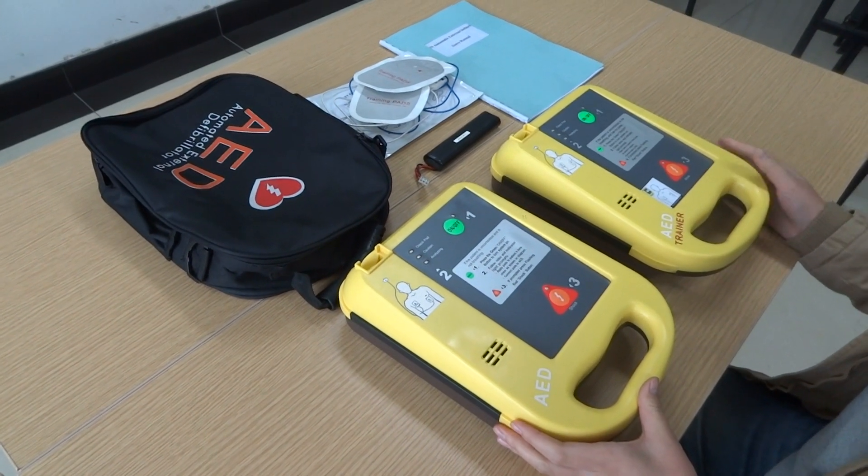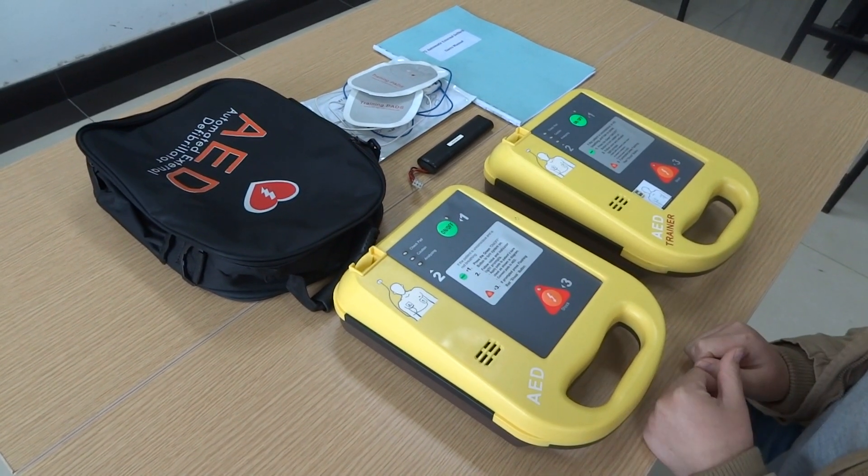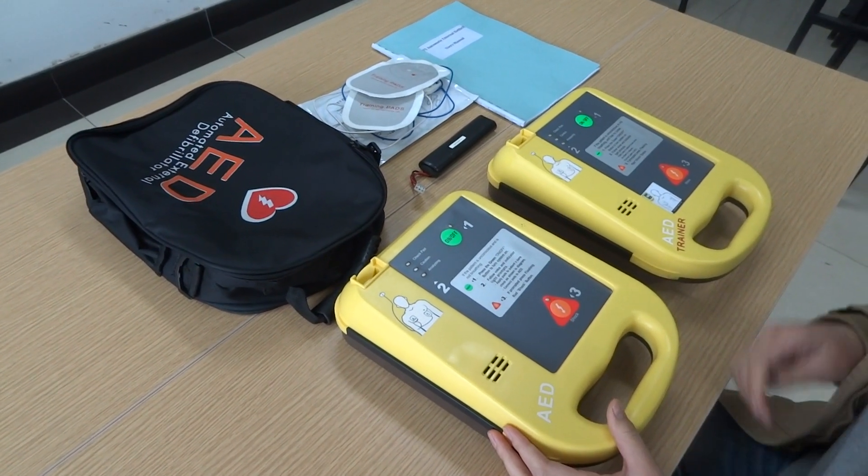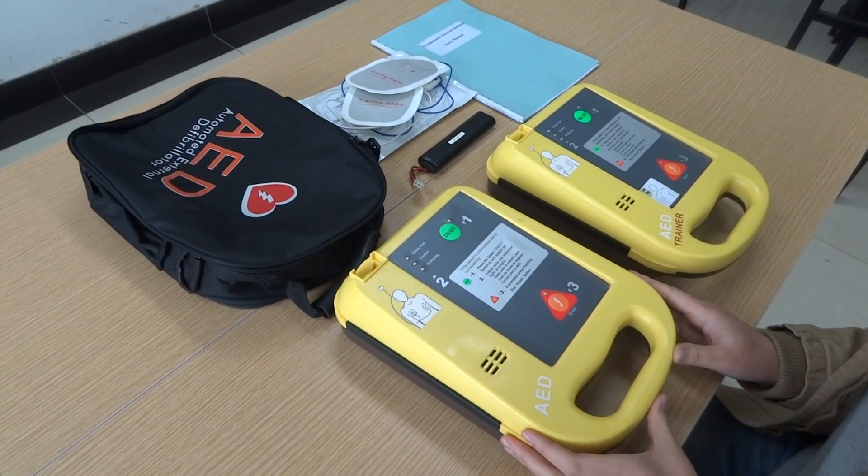Dear customers, thanks for using our automatic external defibrillator. Let me introduce the specific operating methods.